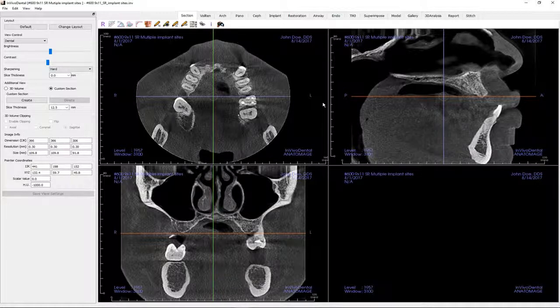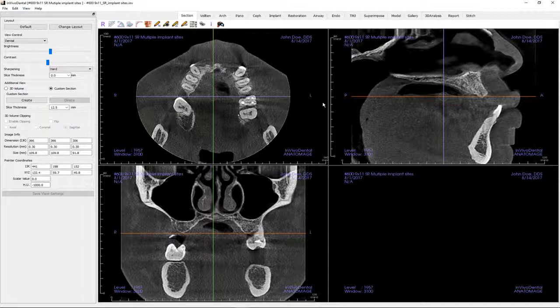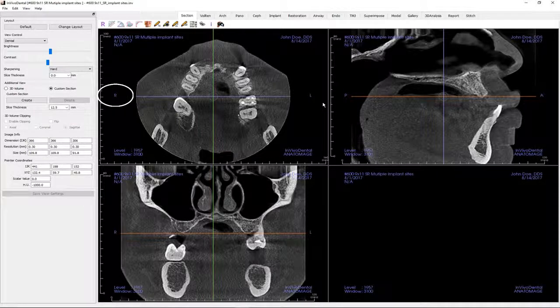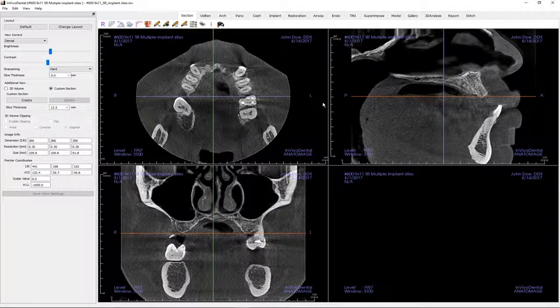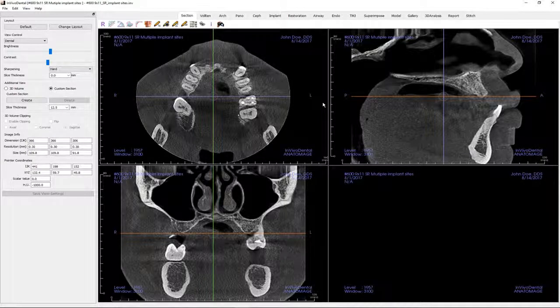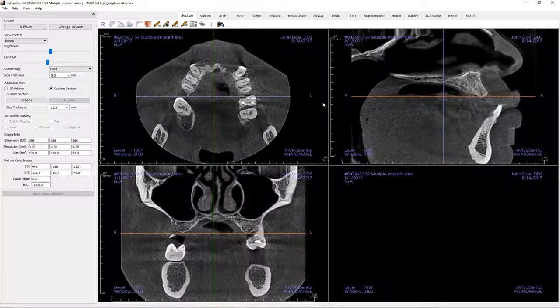The Section View rendering window shows the patient in three-dimensionally reconstructed views displayed in three viewing windows: the axial, coronal, and sagittal, as multi-planar reconstructions. The top left viewing window looks up from the bottom of the patient's head, with the patient's right side on the left of the window. Below that is the coronal view with slices stacked anterior to posterior. At the top right is the sagittal or lateral view with slices stacked right to left.